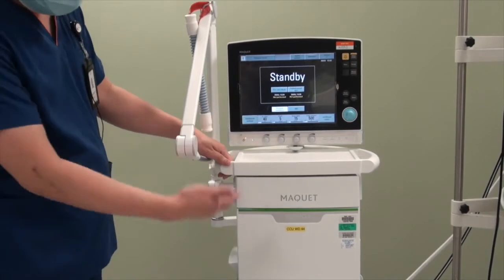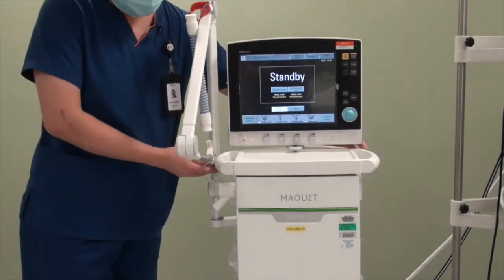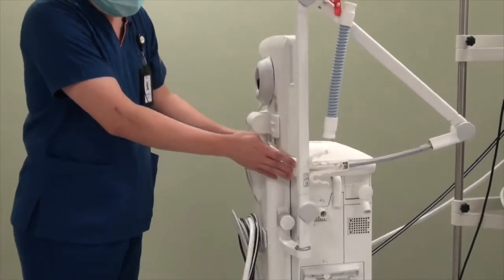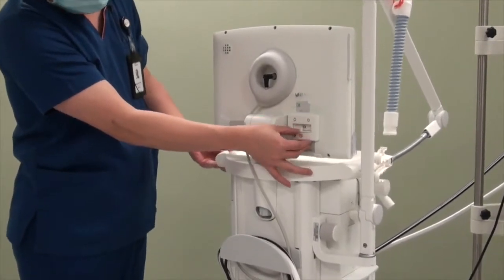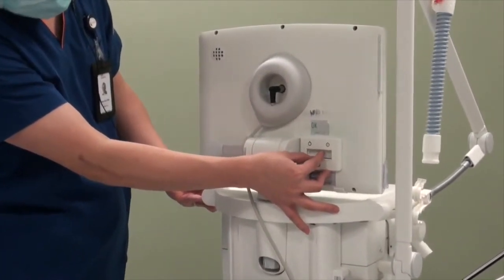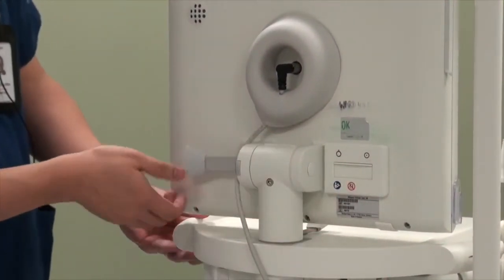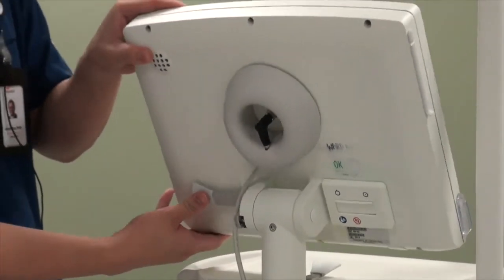This Servo-i comes with a trolley that is supplied by Maquet. The on/off power switch is located at the back of the screen — there's a little flap you can push down and turn to the on and off position. At the back, there is also a lever used to adjust the screen up and down.